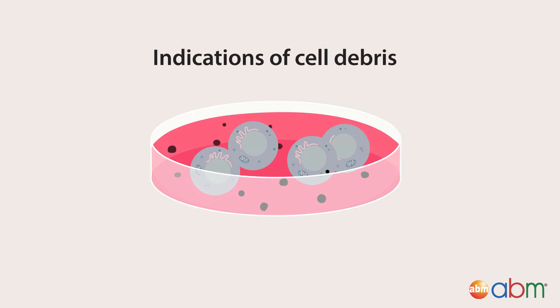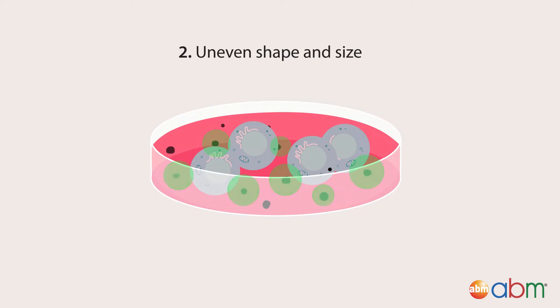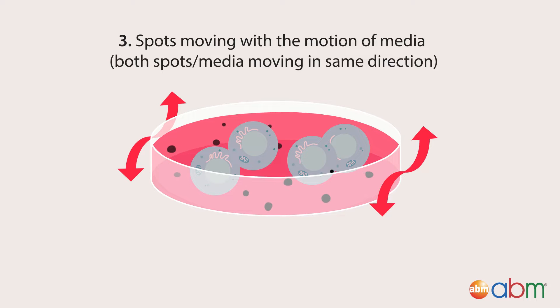Here are some indications that the black spots you're looking at are probably cell debris: if there is no odd media color change or the particles don't increase in number, the particles are uneven in shape and size, and there is no directional movement at high magnification. If the dark spots move with the motion of the media, it is most likely cell debris.